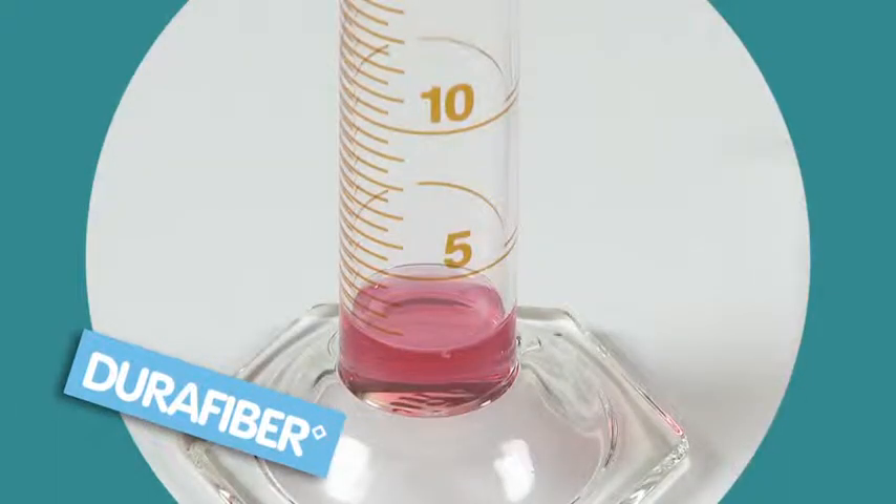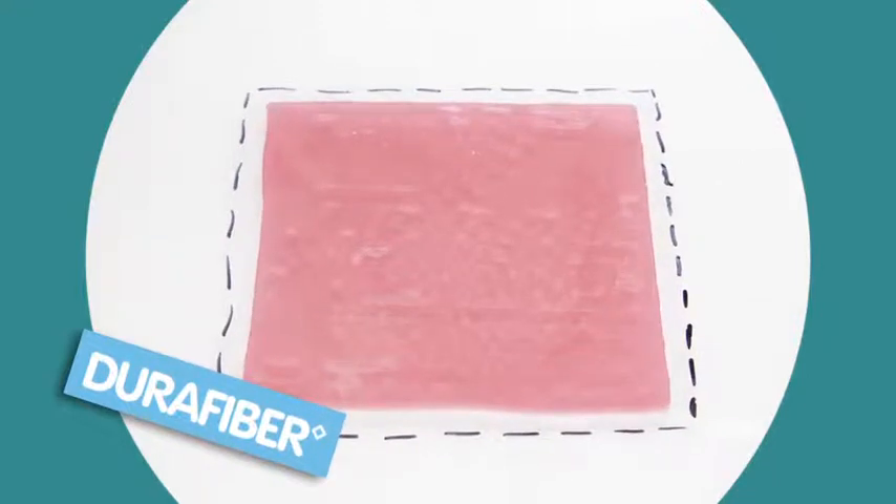There's less than 3 millilitres remaining with DuraFibre, and if we compare the gelled DuraFibre dressing with the dry measurement we see minimal dressing shrinkage.